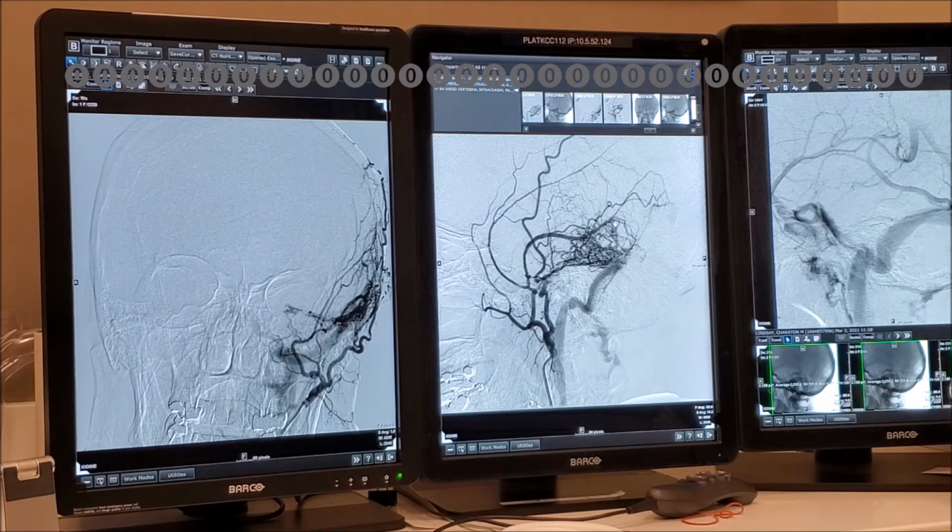How would you treat this thing? Well, initially I thought that the transverse sinus from the point of fistularization proximally is arterialized, therefore it is not functional, therefore you should theoretically be able to coil off that segment of the transverse sinus. But you need to include this. You have to trap it. If you just close it like here, you may miss part of it.